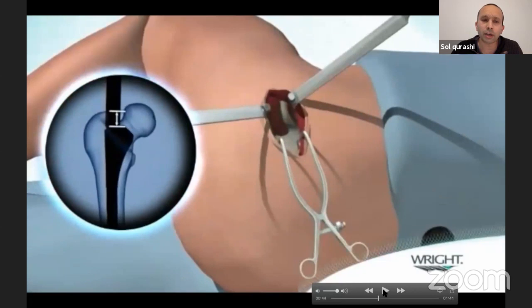Now, the common question here is how do you work out where the femoral stem is sitting? Because when you do a posterior approach, you've made the neck cut and you've got about a finger's breadth above the lesser troch, or that's your landmark, or greater trochanter is your landmark. What's your landmark here? Well, there's plenty of landmarks. You can't actually feel the greater trochanter because there's muscle on top of it. You can't see it either. You might be able to feel a bony prominence. You obviously can't see the lesser trochanter because that's way below and your neck is intact.